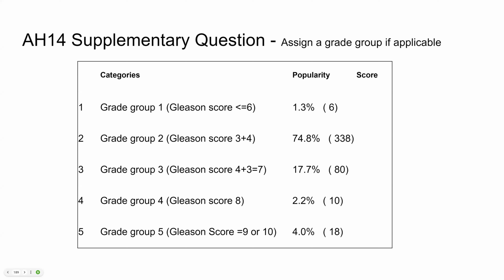So that's our preferred diagnosis as a consensus from the EQA. But there's other, what we would call acceptable Gleason scores. 4+3, I would suggest, was one of those, because some people put in the comments that there was fairly equivalent Gleason pattern 3 and Gleason pattern 4. So I would suggest that would score as 1, really.